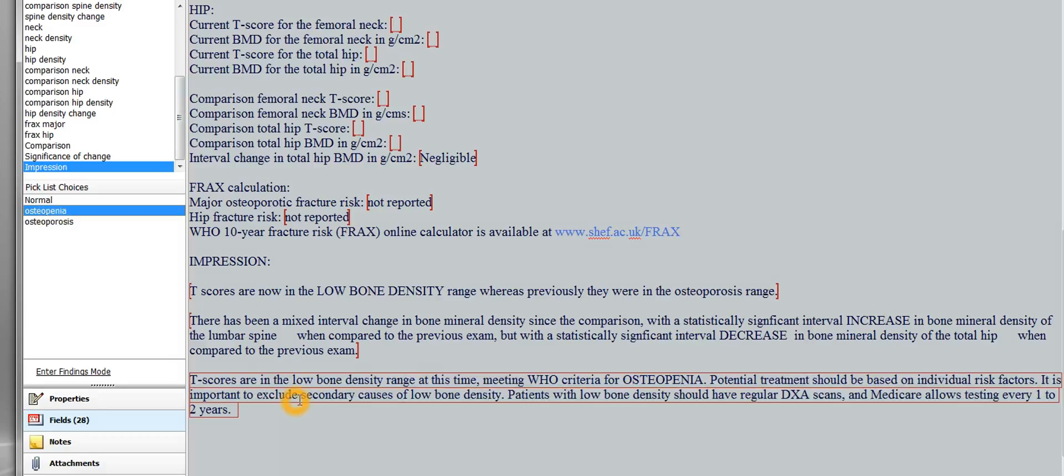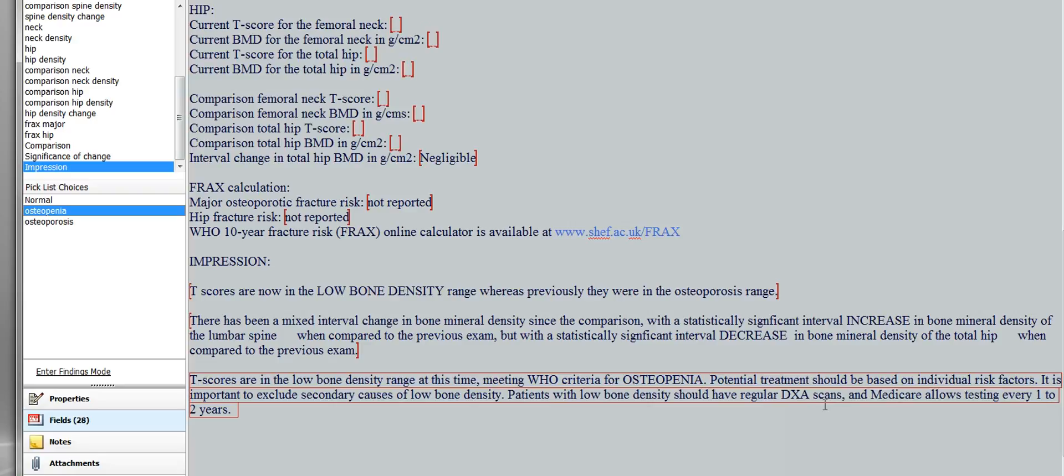And you get T-scores are in the low bone density range at this time, meeting the criteria for osteopenia. Potential treatment should be based on individual risk factors. It is important to exclude secondary causes of low bone density. Patients with low bone density should have regular DEXA scans, and Medicare allows testing every one to two years. So that's what you get for osteopenia, and then osteoporosis.